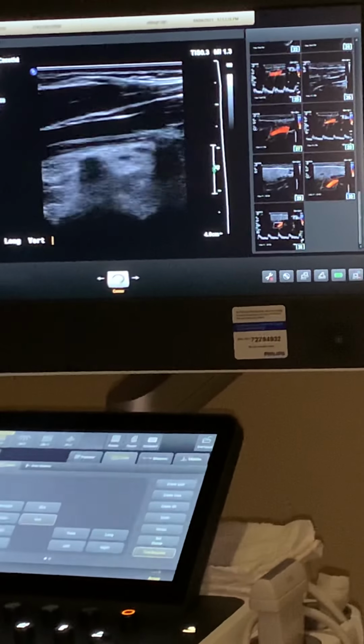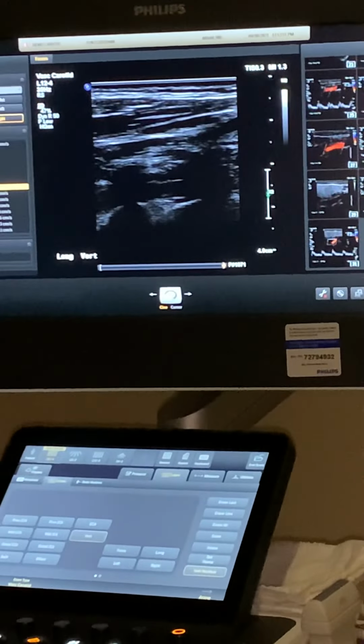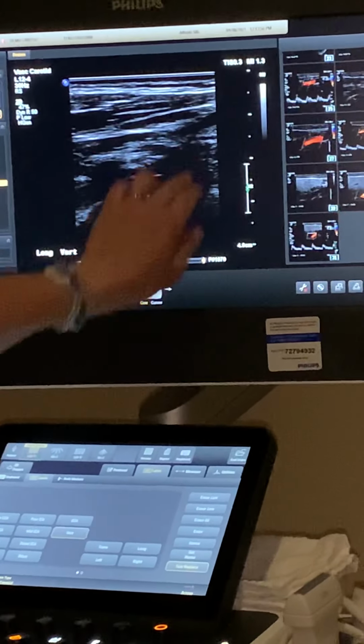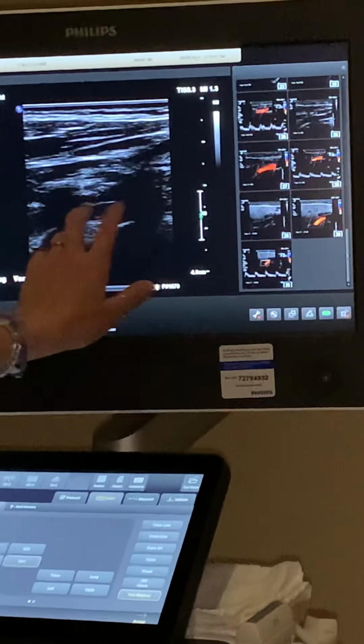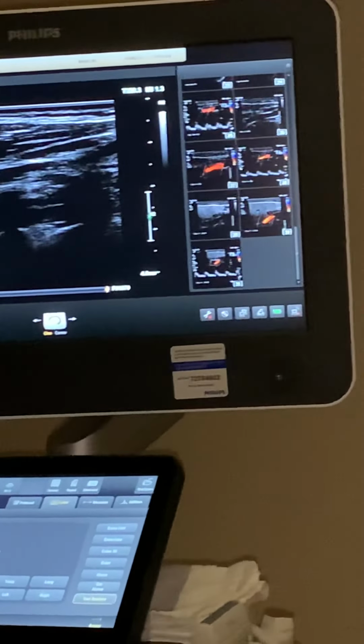And if, coming from this forward position here, you can always slide around on the more posterior side of the neck. Now I've got a little bit better view here. Now I can see it more clearly. And sometimes, occasionally, you have to put the patient's head straight up and down to get it, especially if it's an older person that has disease in their spine. So these are the vertebral bodies here that are going to create this shadow, and then the artery runs in between these bodies. So you'll see it in segments in between these here. So really you just pick one that you can visualize the best and take that sample.